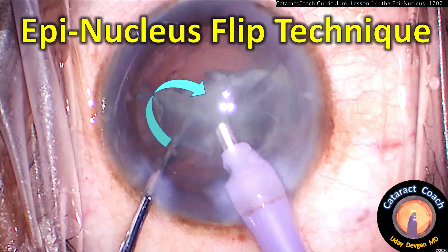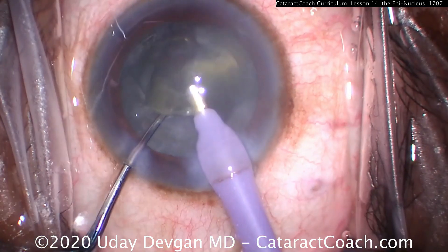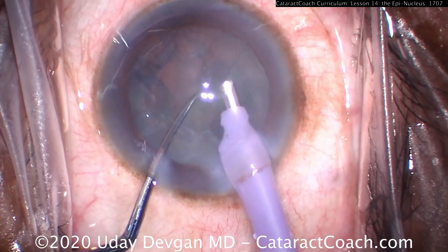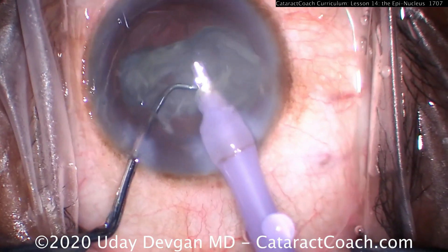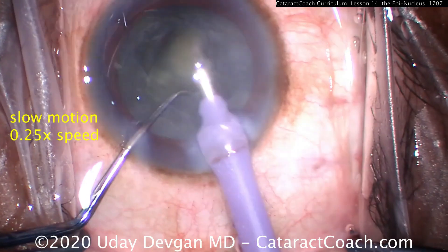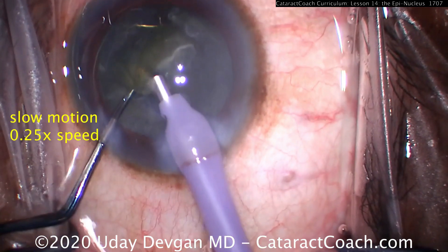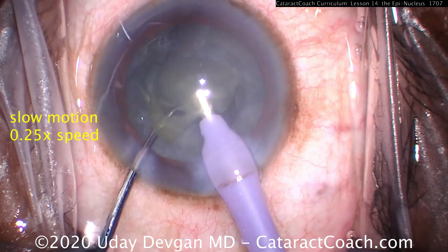The Epinucleus Flip Technique — this makes epinuclear removal safer and easier. Watch in real time: we're removing the last piece of nucleus, and now in the capsular bag there's that thick epinuclear shell. Using just vacuum to grab it, we grab the distal end and use the chopper to flip it upside down, and then we can emulsify it and aspirate it very easily. Let me show you that again in slow motion.